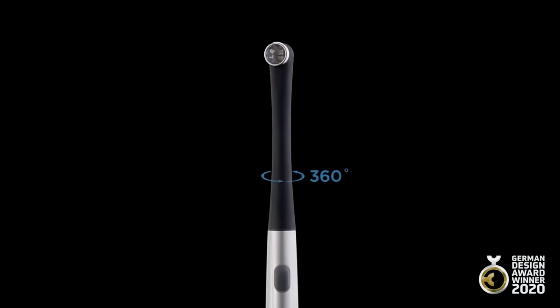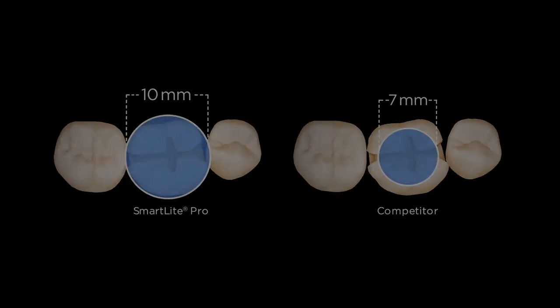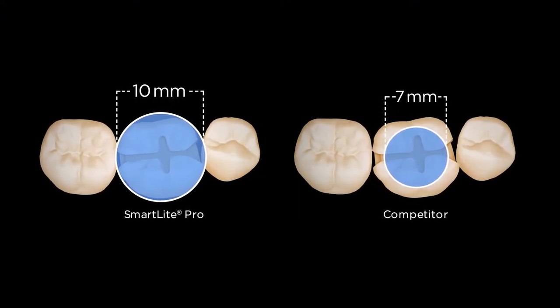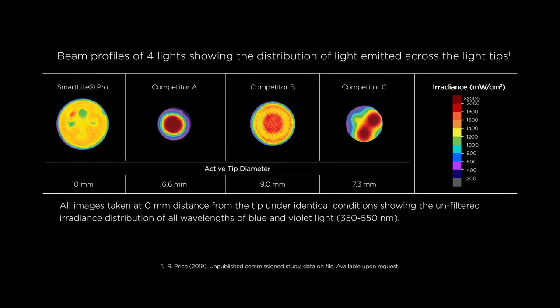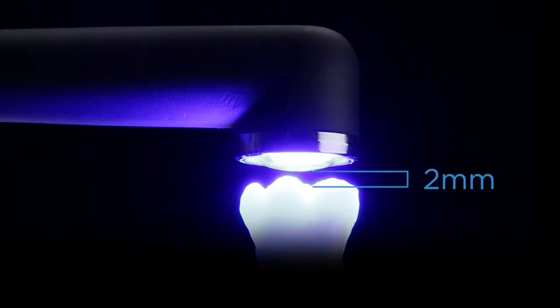The curing tip rotates 360 degrees for excellent intraoral access and convenience. It features four LEDs with an active curing area that's 10 millimeters wide, so you can cure larger restorations in a single step. The newly engineered optics deliver excellent collimation and an optimized beam profile for reliable curing even over larger distances.